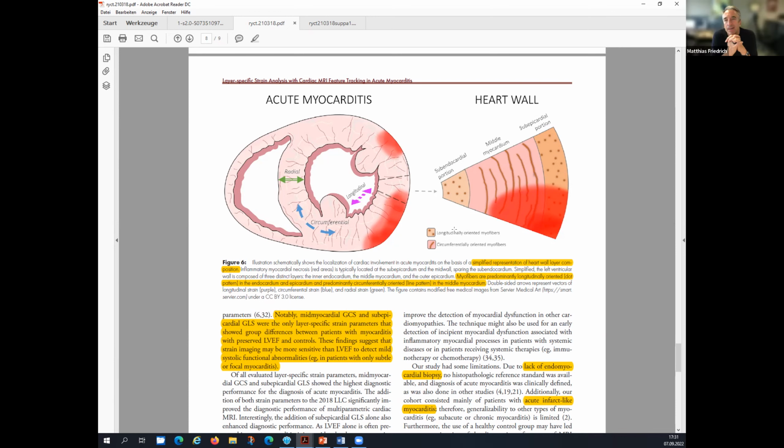Great. Dr. Rafi from Montreal, you have a question. Go ahead. Thank you so much for your excellent presentation. Is it possible to use this method for diagnosis of subendocardial infarction as a non-contrast cardiac MR? Do you have any experience? So instead of giving contrast, you do, if I understand correctly, a native scan without applying contrast and then make your diagnosis with the software. Yes, with layer strain study.